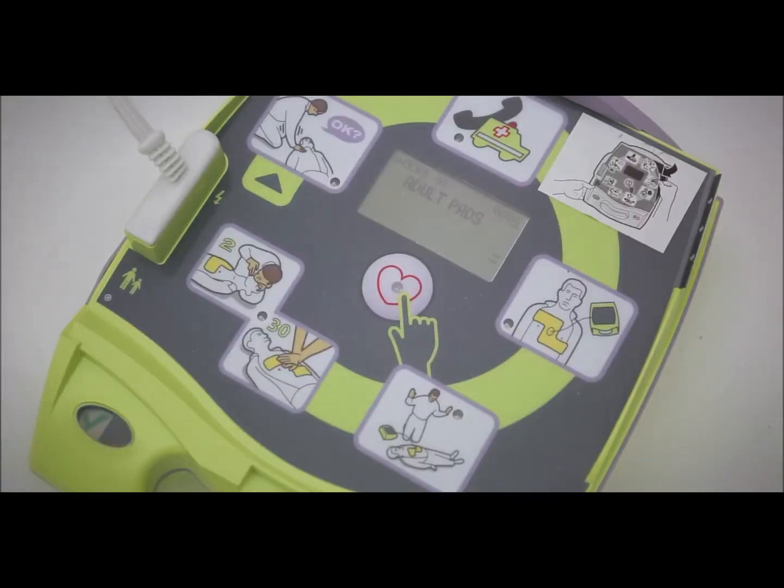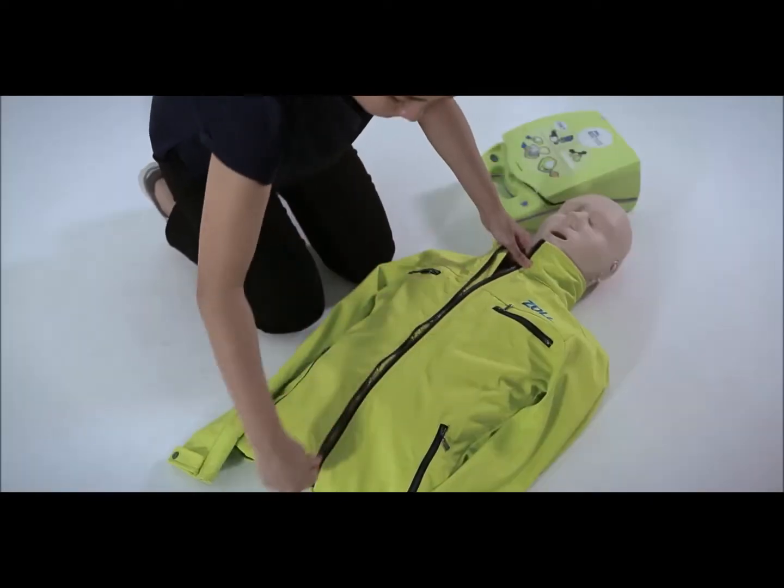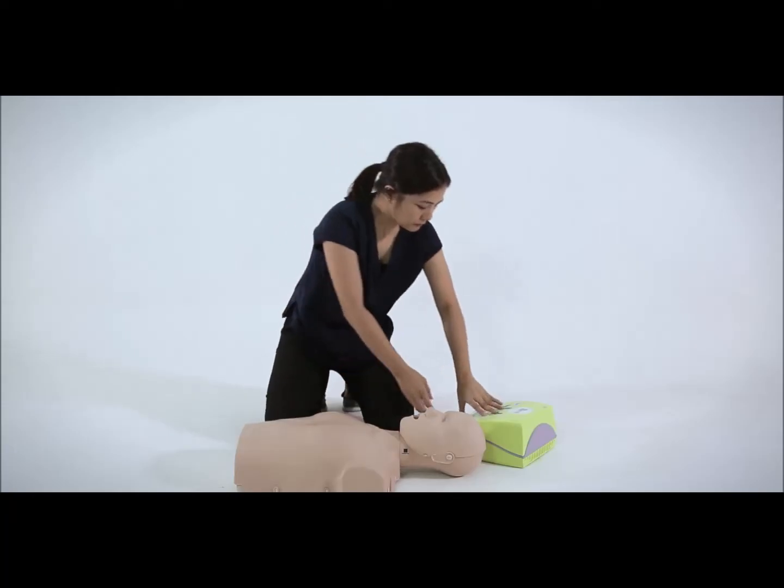The AED will prompt you through the process: unit status, adult mode, stay calm, check responsiveness, and call for help. Remember to remove the victim's clothes to expose his or her bare chest before attaching the electrode pads.